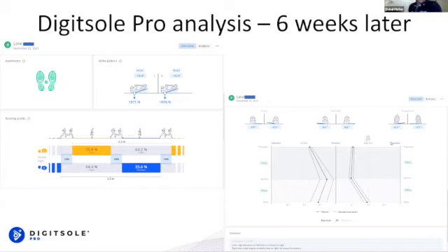What we see here, and what was a remarkable thing, is that the standard deviation on her left leg has actually increased from a general perspective. So what is to be argued is that from where we are here at the 25th of November, one of the key aspects for her is that she really has to work on her balance and control of the left foot. That is probably the outtake we can take from this.